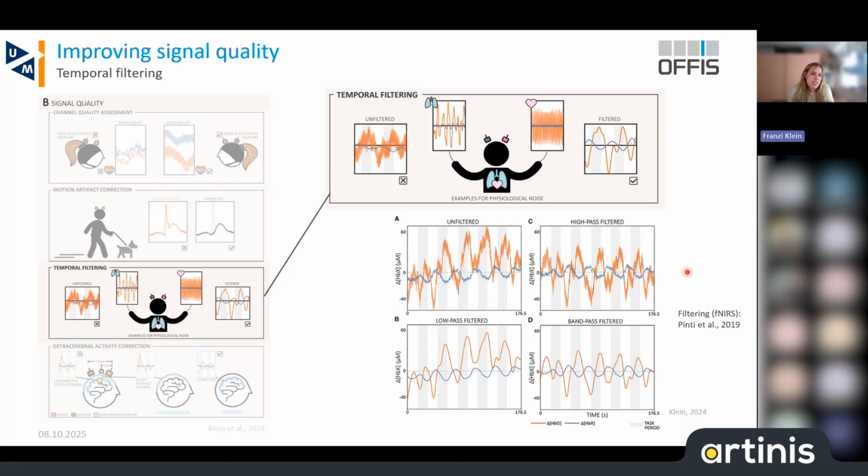But we cannot use zero-phase filters here, because for that one, you need to know the information from the future, which we don't have, of course. We always have a new point coming in, but we don't know what is happening in the end. So it's a bit different, and you always have to be a bit careful with real-time filtering.